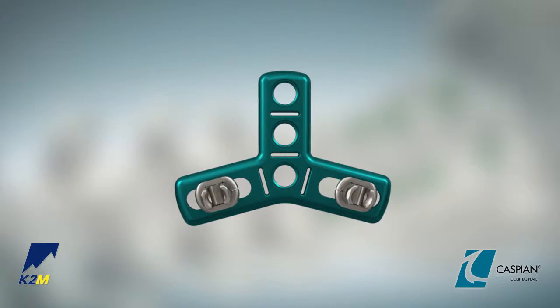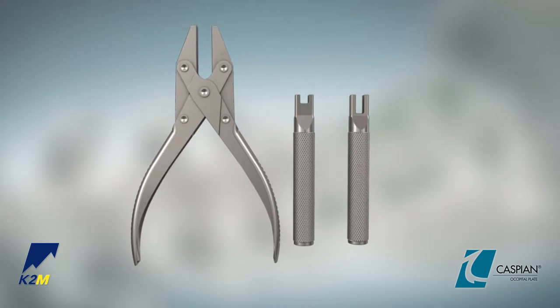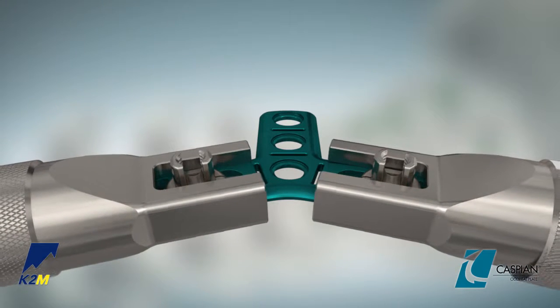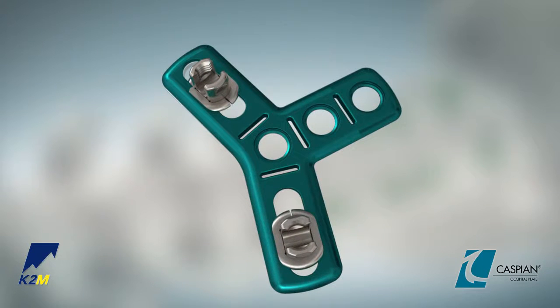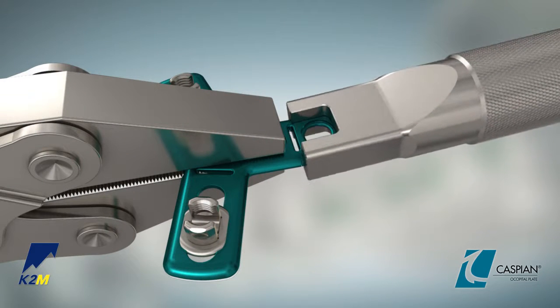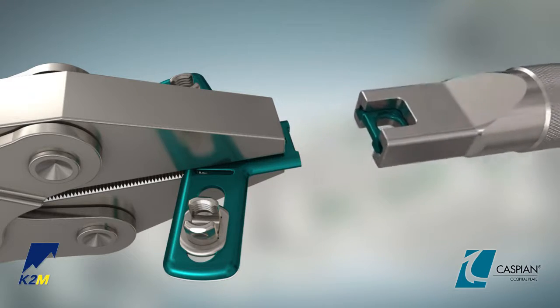To facilitate bending, the plate features bend zones at each of the lateral wings, as well as notches between the midline screw holes. Both parallel pliers and short and long occipital plate benders are available for contouring. The plate benders can be slipped over the wings or center tab on the plate. If placement of only two midline screws is preferable to three, the superior screw hole may be removed by supporting the plate with the parallel pliers and using the short plate bender to bend the screw hole back and forth until it is separated from the plate.